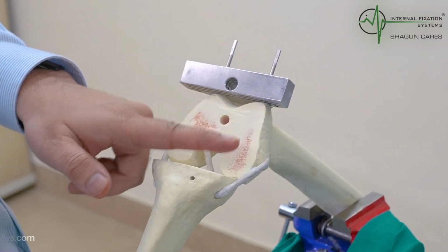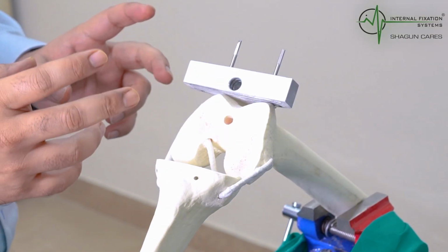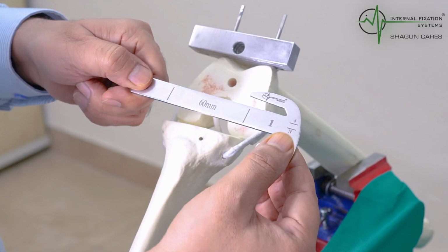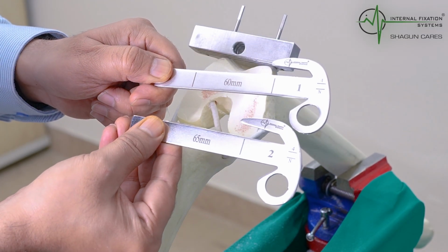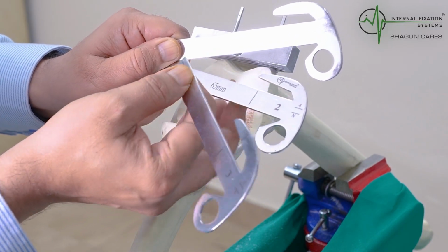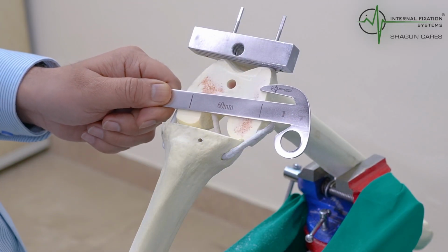Now we have taken both the cuts. Now we are going to just see the sizing. The 60 is the smallest, and then you have 65 and then 70. So you have three sizes. Let us see which one fits.